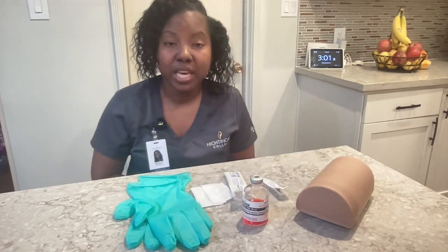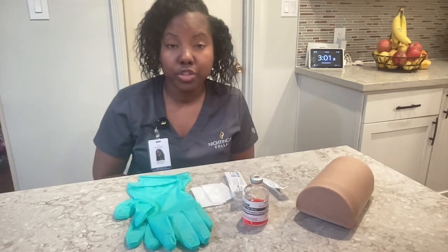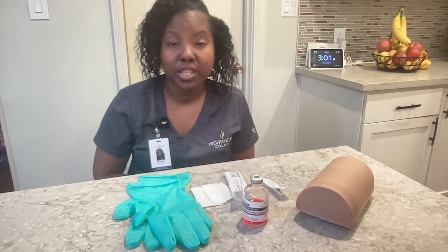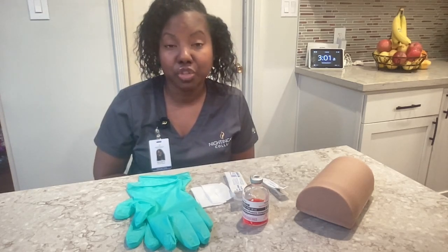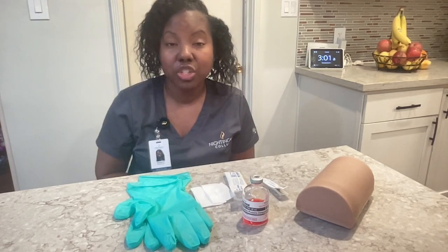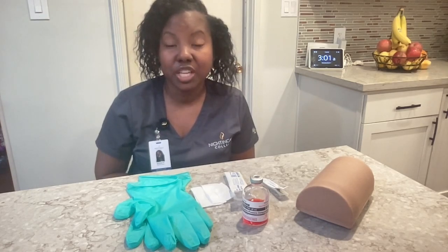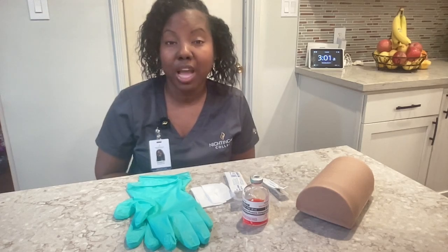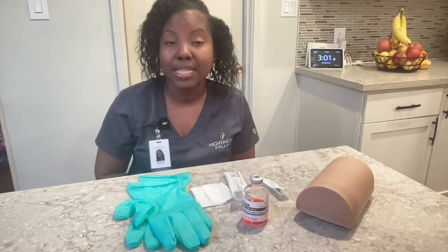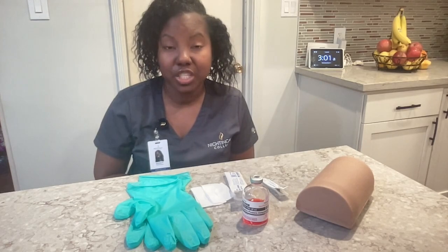I will begin by verifying the physician orders. I will check the six rights of medication administration, ensuring that I have the right patient, the right drug, the right dose, the right route, the right time, and the right documentation.